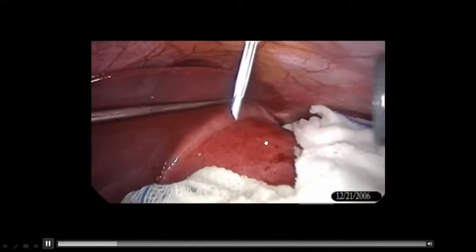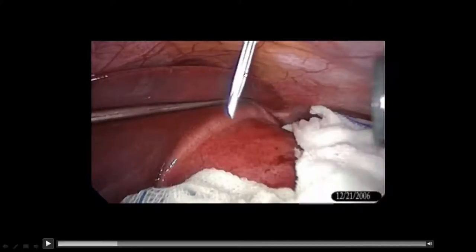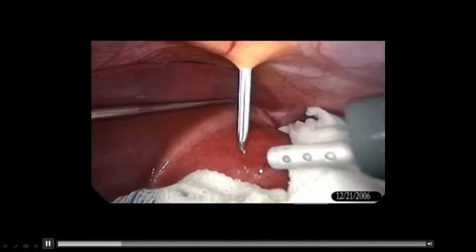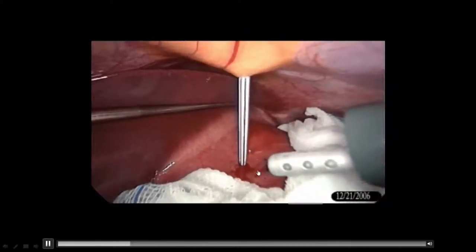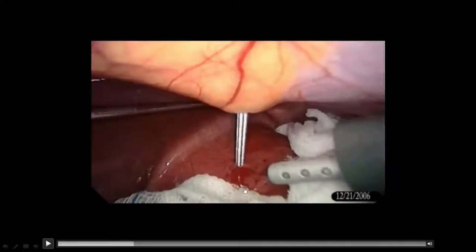After that, you should take a spinal needle and percutaneously puncture over the cyst. And after puncturing, you will do the negative balancing. You should take 10 ml of the fluid out and replace it with 5 ml of hypertonic saline.